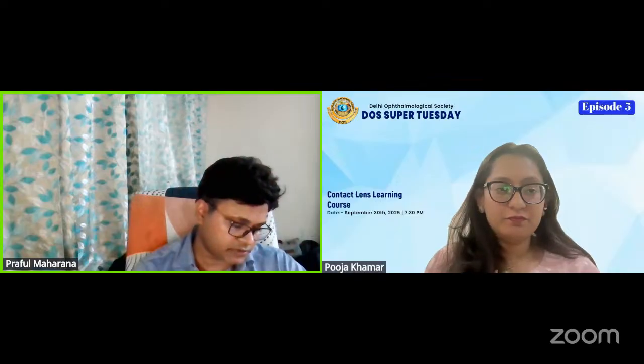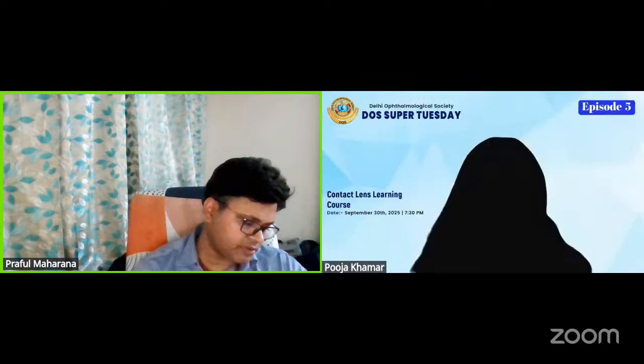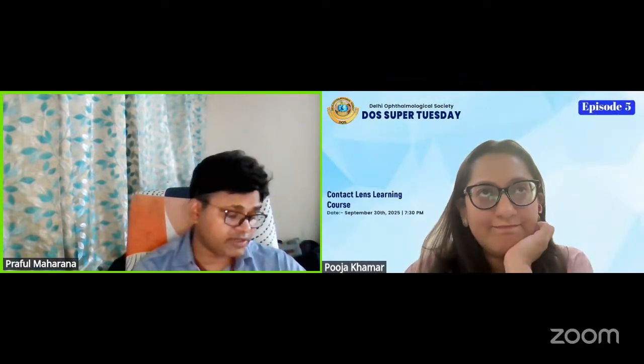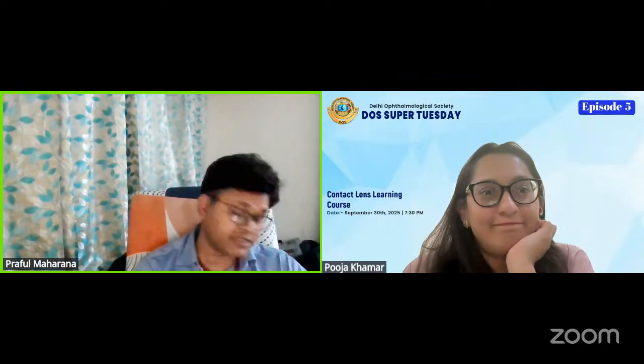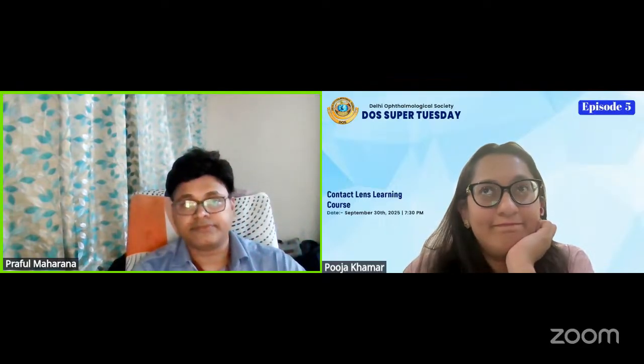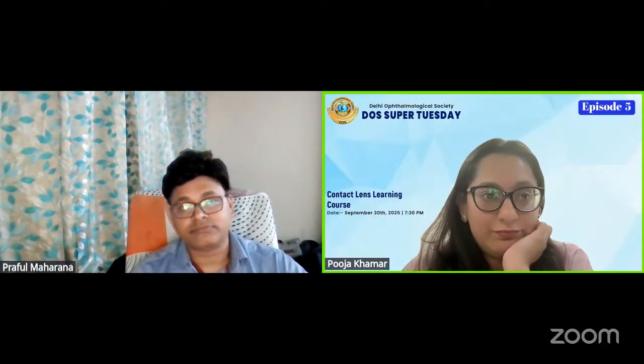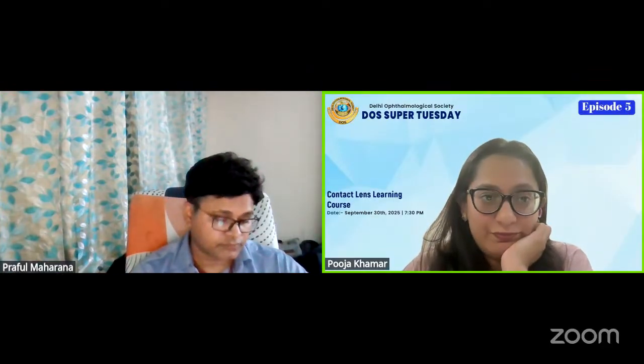Okay, one more question. Do you prefer any choice of IOL? It's about the choice of IOL. Would you prefer multifocal IOL if the patient is already having dry eye before cataract surgery? No. The first answer is going to be no.